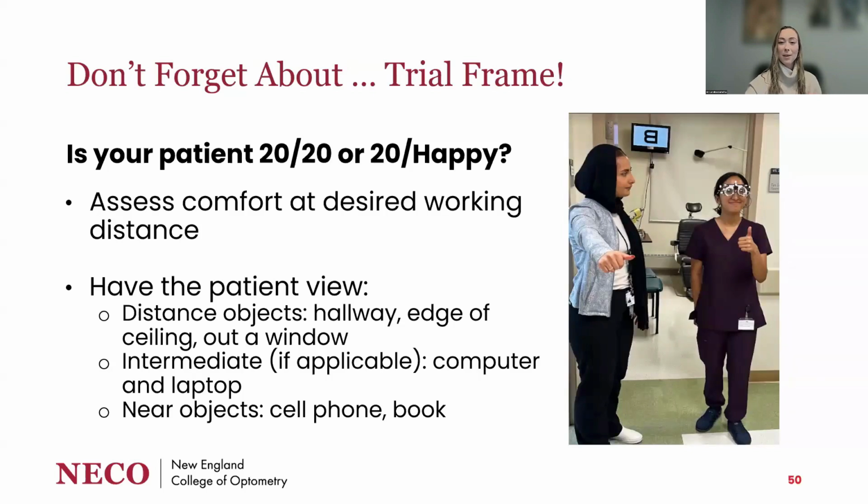This is the step that we should be taking with every patient to make sure that their glasses not only give them good clear vision, but also very functional vision for their lifestyle. Have the patient view distance objects that are far away. I like either the end of the hallway or even out a window. That'll simulate what it might be like when they're driving or using their glasses looking at very far distances.